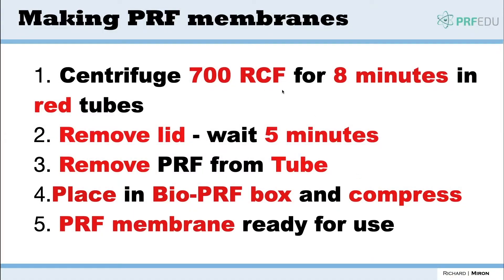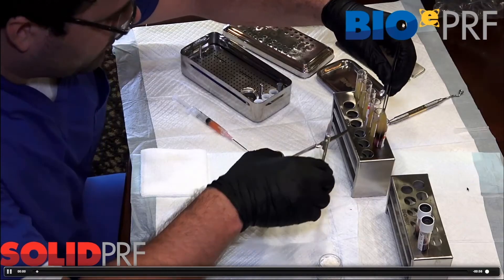We're going to centrifuge at 700 RCF for 8 minutes. We're going to remove the lids, then place it in the BioPureF box and compress — then the membranes will be ready to use.